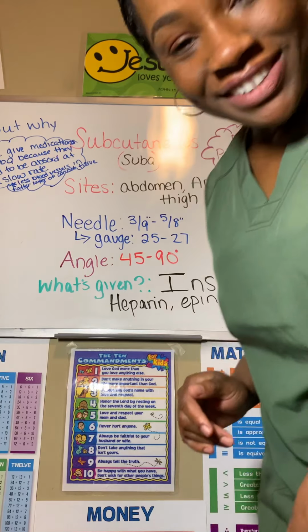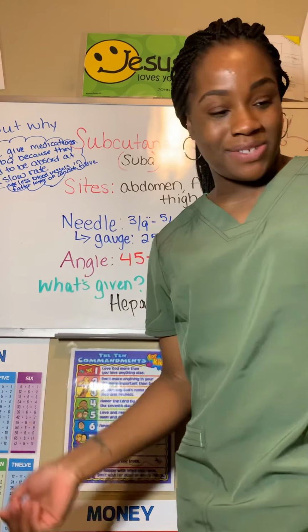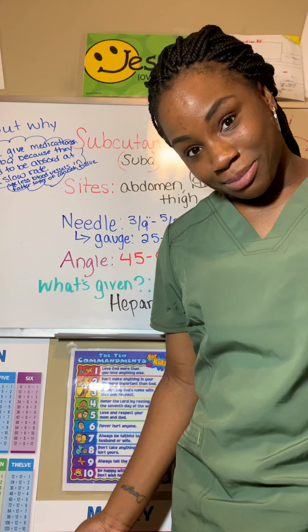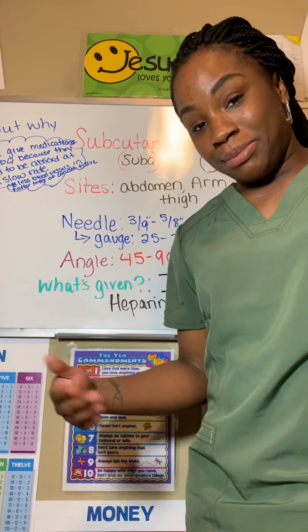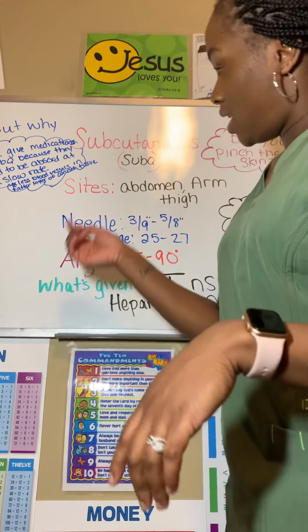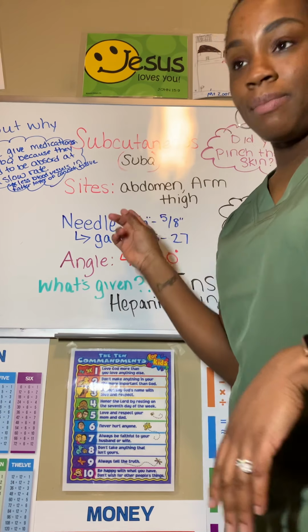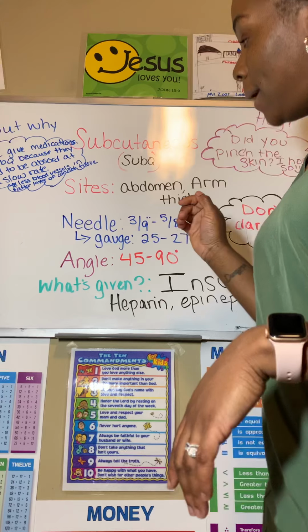Okay, so today I would like to demonstrate how to administer medication subcutaneously. Let me just get to the point, right? Okay, so before I actually demonstrate that, I want to go over some key points that you should keep in mind. So, subcutaneous is also referred to as subcu. That's the medical abbreviation of subcutaneous, okay?